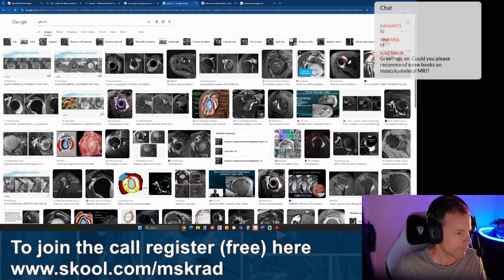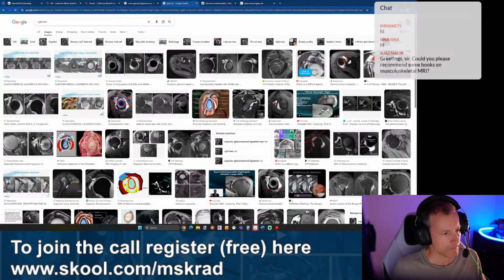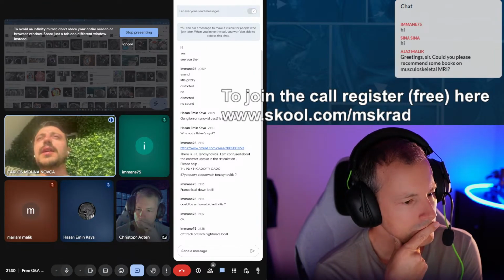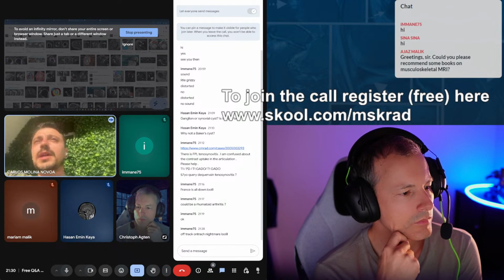I have a question that just came up, but I don't have a case to support it, but maybe in theory you can answer, Chris. The other day a colleague and I had a disagreement, because she called osteomyelitis in a patient where the T1 was just slightly grayish, not really black, but they did administer contrast, so it did enhance a little bit.